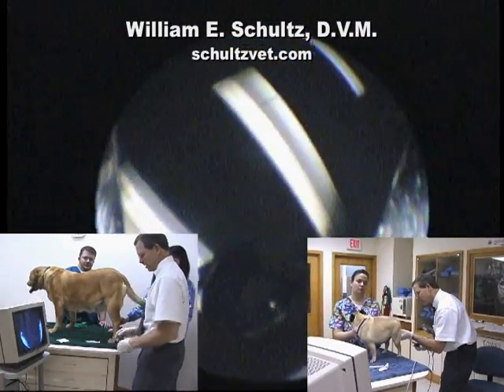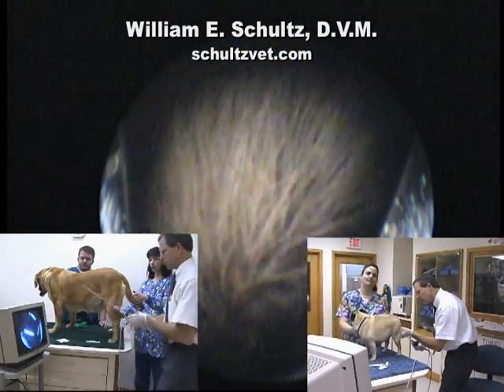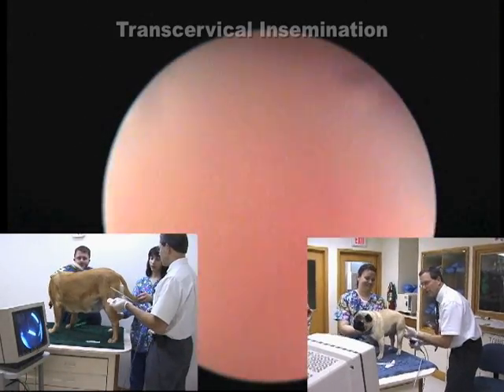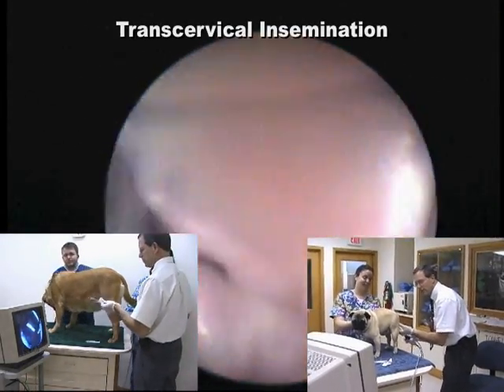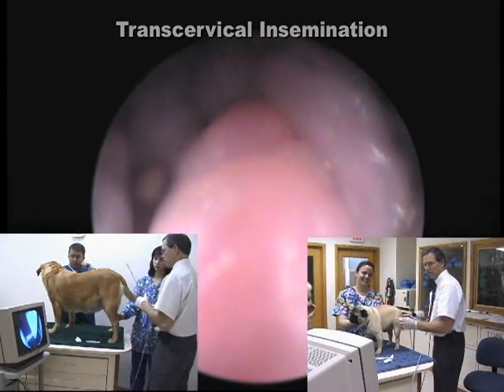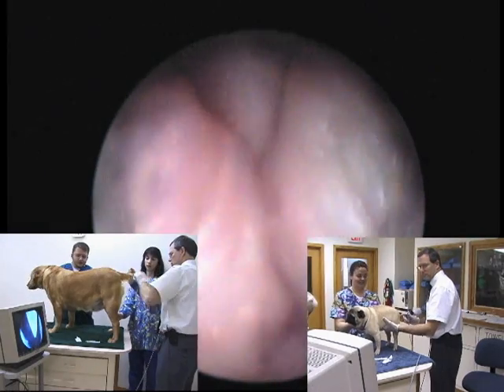In this video, we will be showing a large and small dog having a transcervical insemination. They're both short scopes. One is a rhinoscope that holds a 5 French catheter as a maximum size. The other scope is larger and will hold up to a 10 French catheter, but we typically use an 8 French.